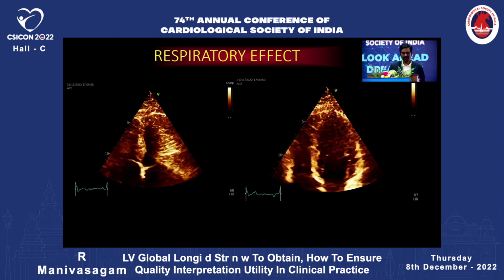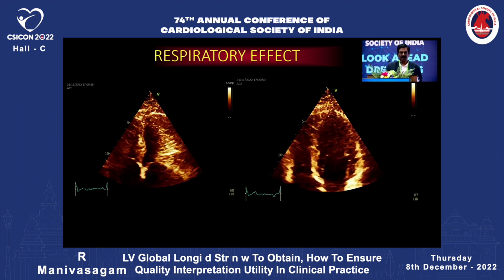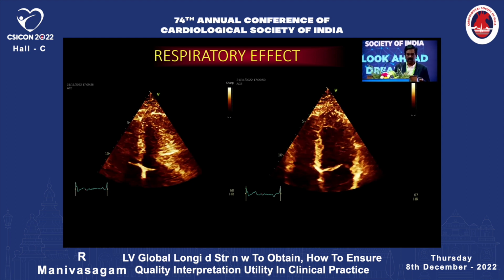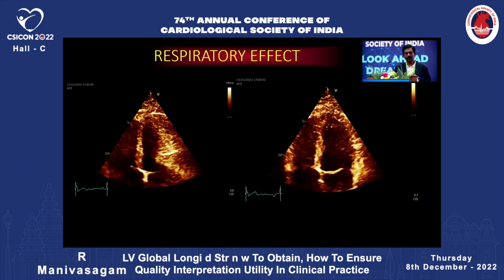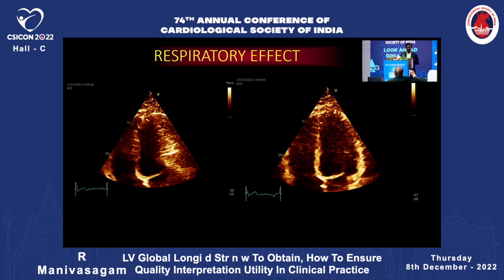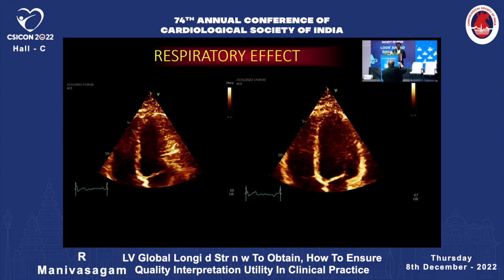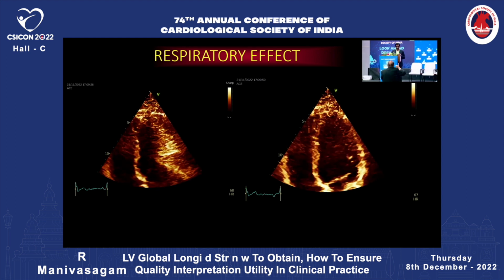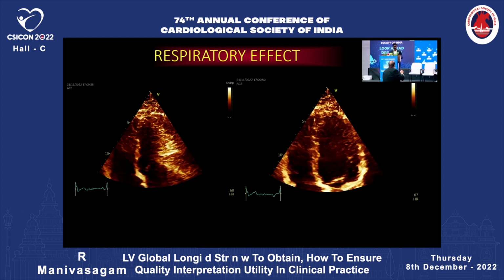So when you are getting the total global longitudinal strain, how is it calculated? It gives you approximately 1/3 of the ejection fraction, 2/3 are decided by the... No. What I'm saying is, because it's a basic session, so we're just interrupting. You're looking at the peak strain in different segments. For example, if you're looking at the septum, you're looking at the peak GLS strain in different segments, and then you're averaging it. So what you're getting is average peak. So we are global average strain. Global longitudinal strain, global average strain.